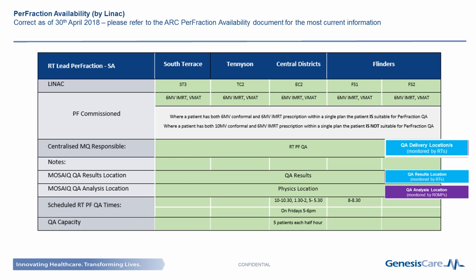On Fridays, the 5:30 slot will be increased to an hour from 5 till 6 to prepare for next week's new cases. Siemens Linacs are not part of RT-led PerFraction distributed QA model at ARC. I'll provide more details for you regarding this in a moment.